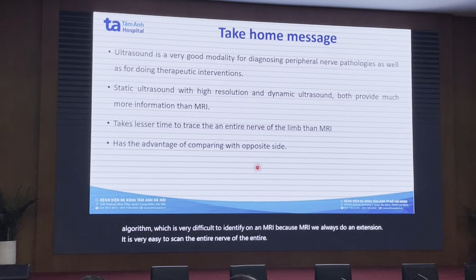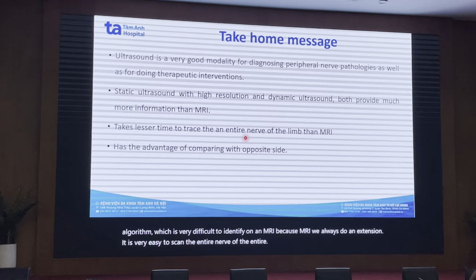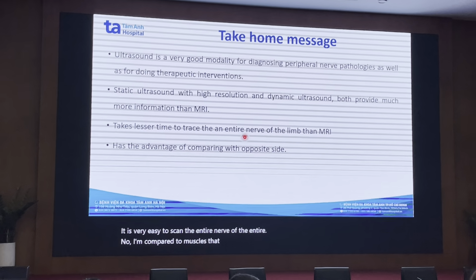MRI will take a much longer time, and then always compare with the opposite side. Compare the nerve and compare the muscles that are being supplied by that nerve.